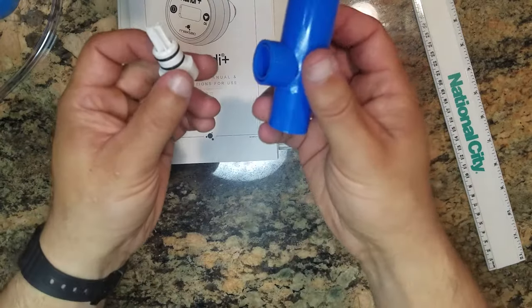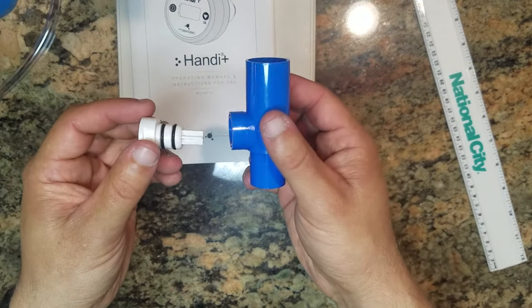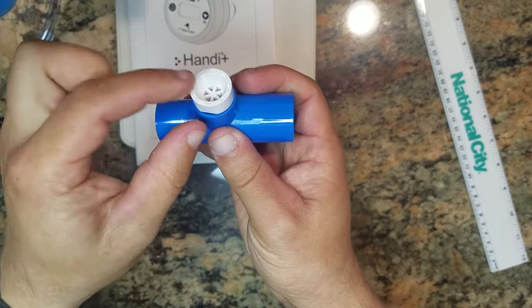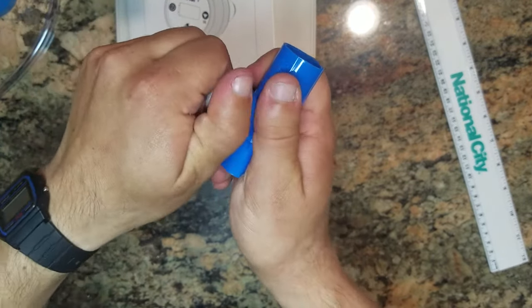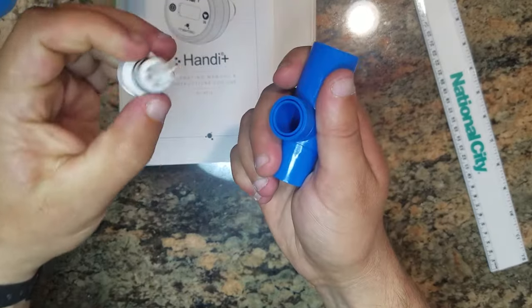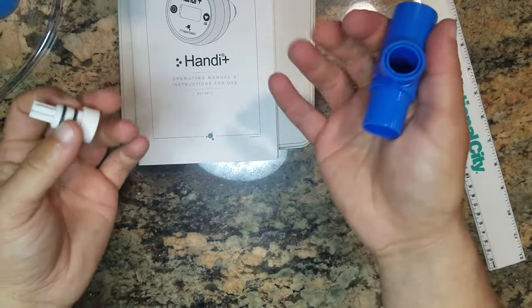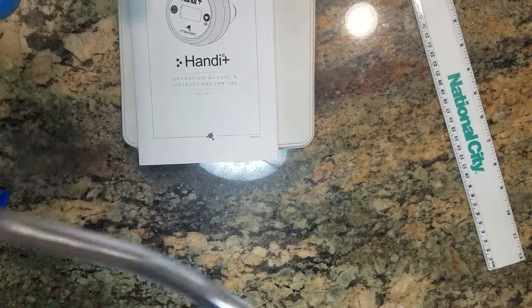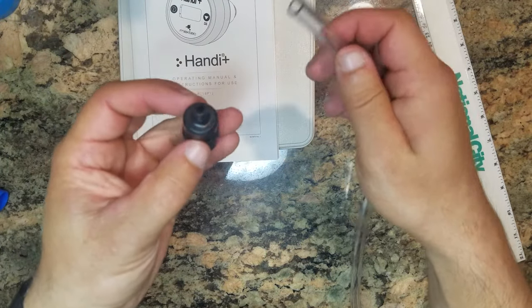So this is the T-adapter. We've also got some connections — this piece has a thread here to connect to your gas source or a calibration bottle, and then the hose is going to connect to this black piece here, and you screw these together.